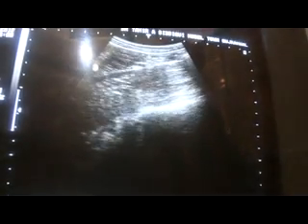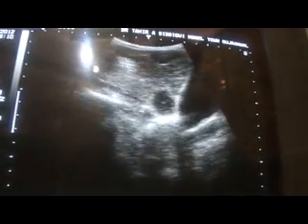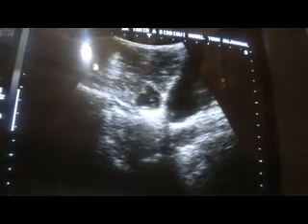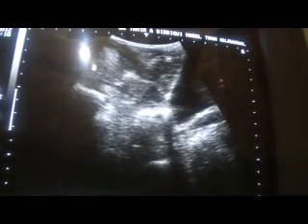This is the muscle. This is the psoas muscle, major muscle, this one. These are bowel segments. You will see movement, the change in their position, and internal floating tiny particles in it. These are our bowels.